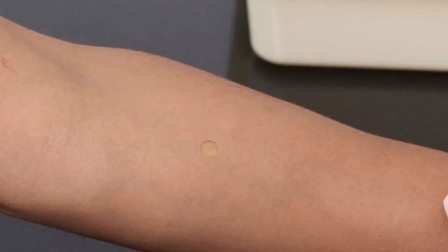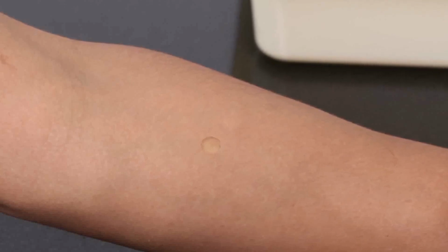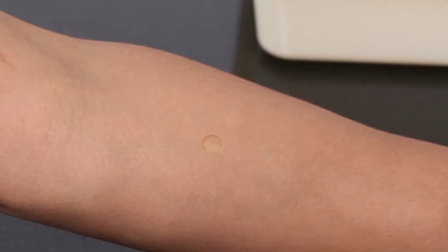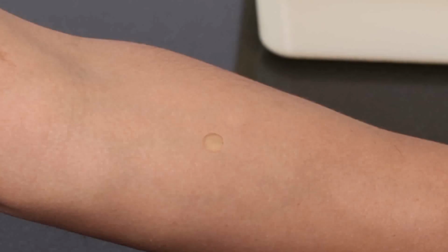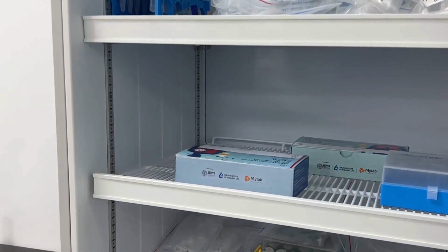A 6 to 10 mm wheal or papule is formed. It is a pale, raised area with distinct edges, having orange peel appearance that does not disappear immediately. Return the vial to the refrigerator after administering the solution.